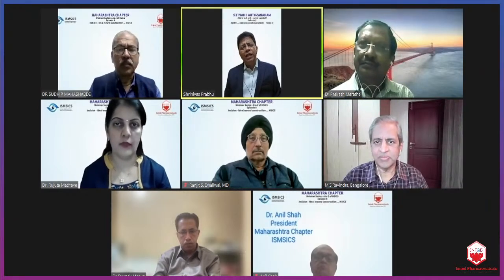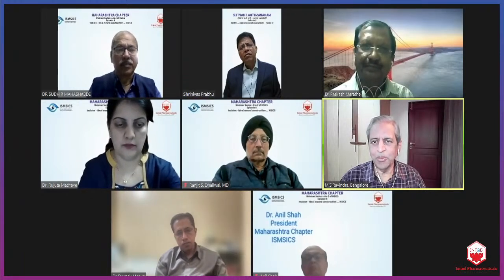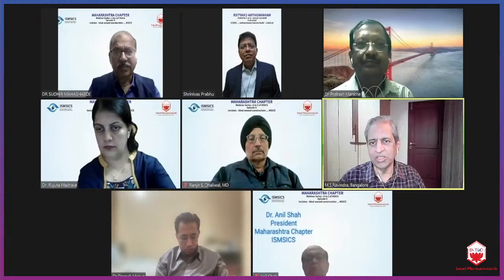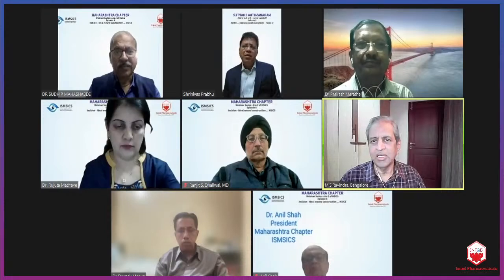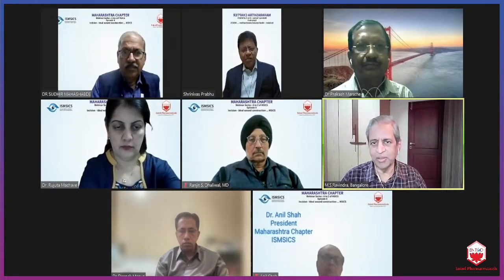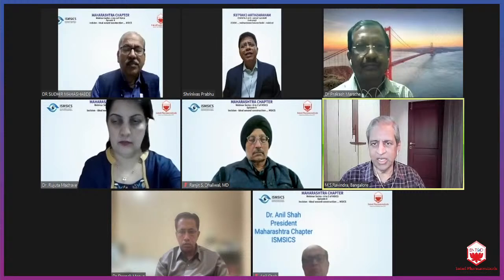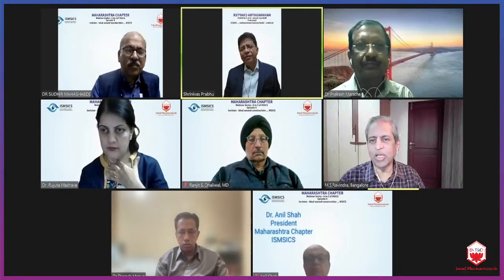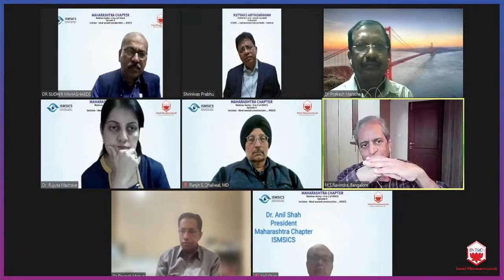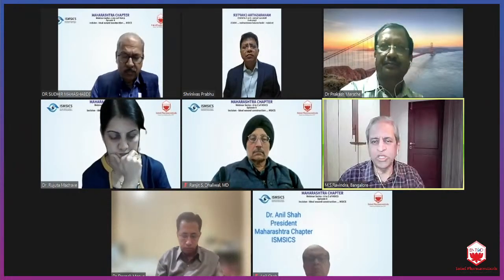What are the chances of epithelial downgrowth in that case? Nil. I've never seen it, and I've been doing this for 3-4 years now. Epithelial downgrowth occurs only when you have damaged endothelium. It's a well-established fact. If a few epithelial cells have gone inside, the body will destroy them. But if the endothelium is damaged along with it, like we used to do with our intracapsular technique, then epithelial growth occurs. Here, this scleral tunnel closes completely, so there's no question of anything growing inside once you form the chamber. That's a good question.